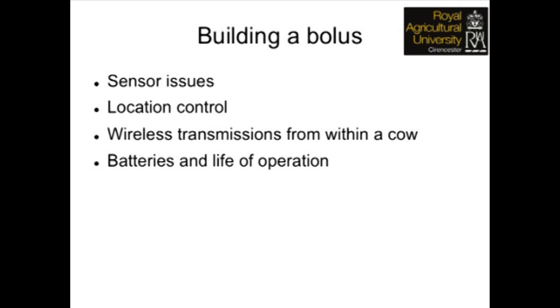In that original Johnson and Sutton paper, they were taking the rumen pH meter out and cleaning it up every 2 days. Now clearly that doesn't work with the non-fistulated cows. So there's two main sensor possibilities. One is what's called an ISFET sensor. That is a plastic membrane and will measure quite accurately, but unfortunately the rumen is not a nice place for a piece of plastic. The alternative is to use a tried and tested sensor, which is unfortunately quite large with a glass bulb. They tend to be the most stable, but obviously you have to protect that glass bulb.